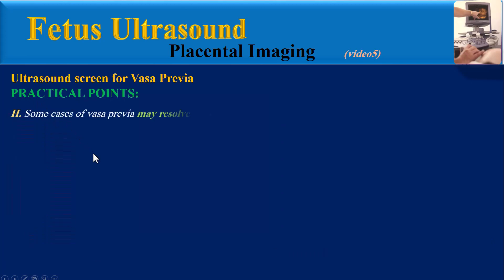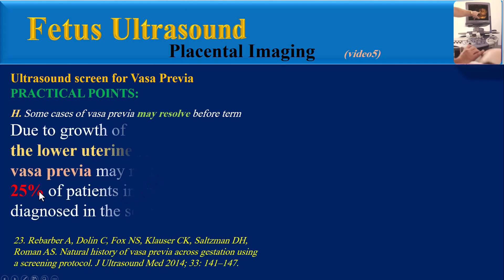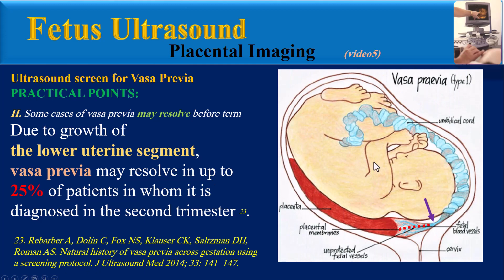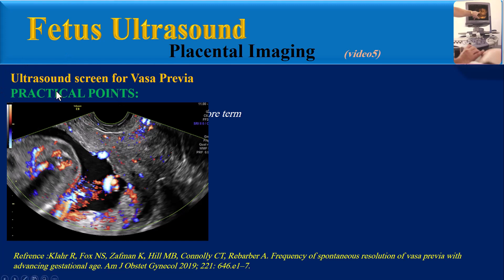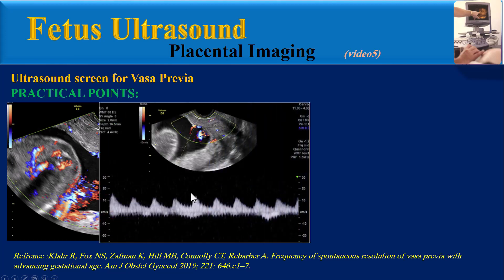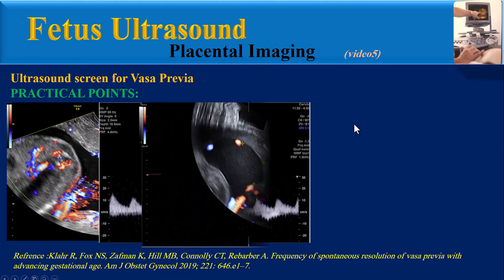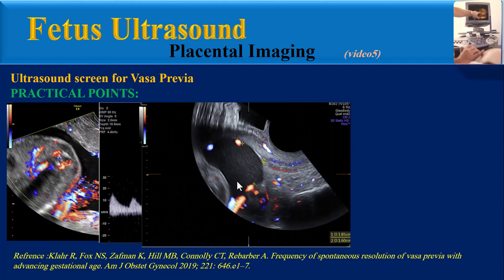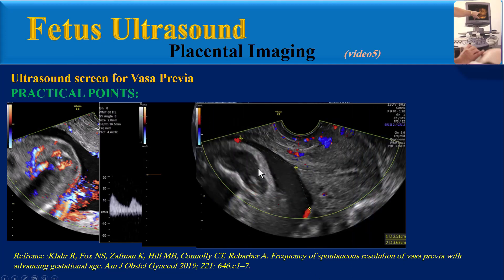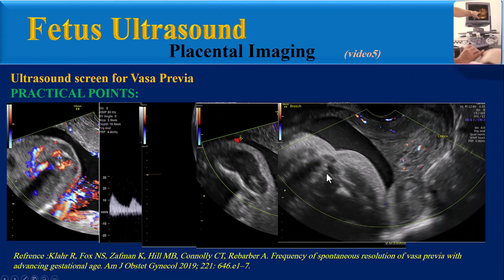Another practical point: some cases of Vasa Previa may resolve before term. Due to growth of the lower uterine segment, Vasa Previa may resolve in up to 25% of patients in whom it is diagnosed in the second trimester. A color Doppler image at 20 weeks gestation shows Vasa Previa overlying the internal cervical os, confirmed with pulsed wave Doppler showing fetal cardiac rate. At 27 weeks, migration of fetal vessels from the internal os is visible, and at 30 weeks further migration is seen.